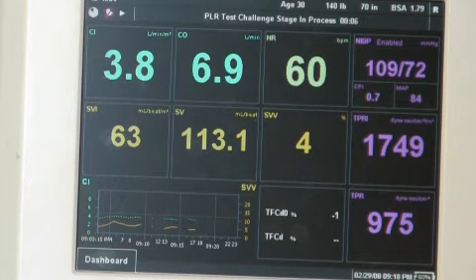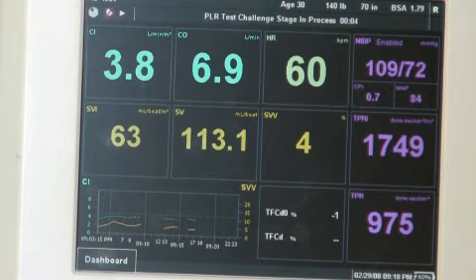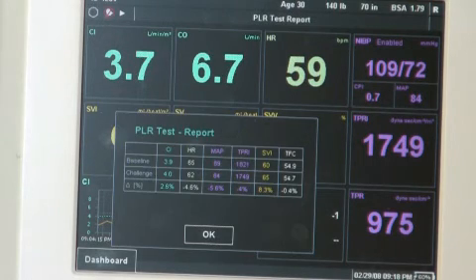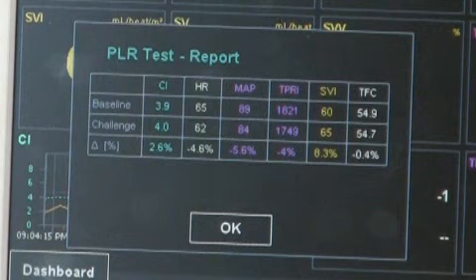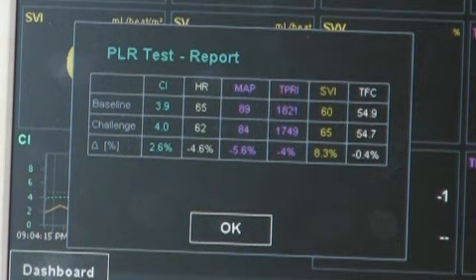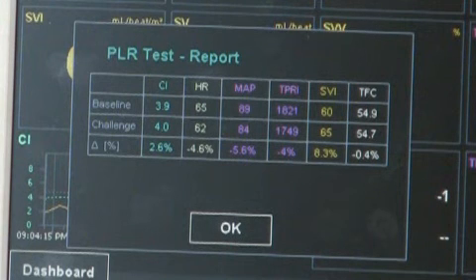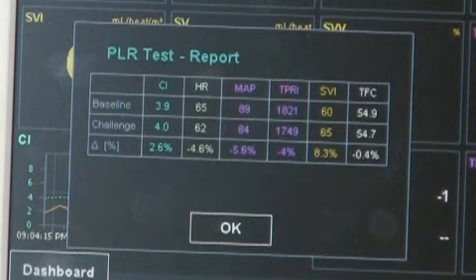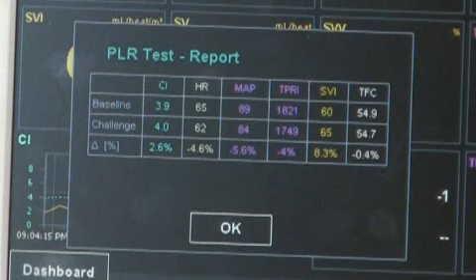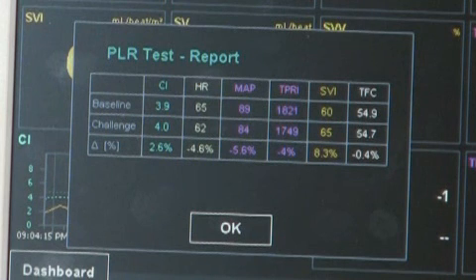At the end of the 3-minute challenge, you'll see the PLR Test Report — this is when you make your assessment. The report indicates that the change in SV is less than 10%, meaning this patient is not fluid responsive. Giving him an IV fluid infusion will not result in increased cardiac output and perfusion. If the report indicates that the SV rise is more than 10%, the patient is fluid responsive, which means that he will increase his cardiac output and perfusion.